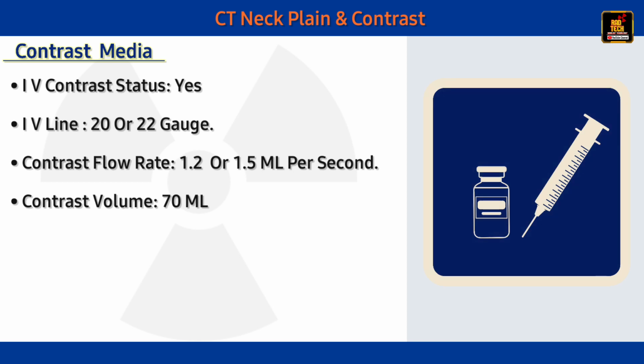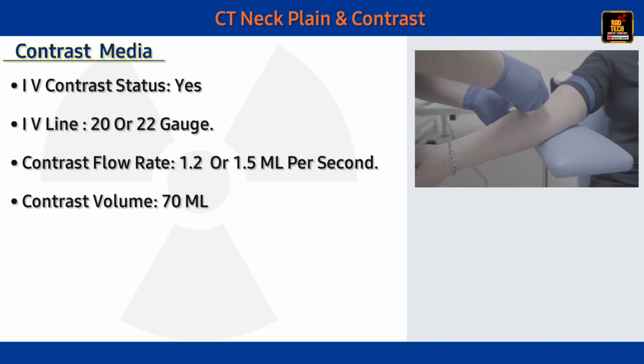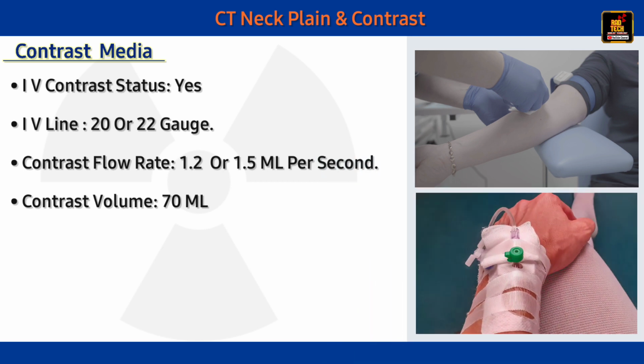Contrast media. IV contrast status, yes. IV line, 20 or 22 gauge. Contrast flow rate, 1.2 or 1.5 ml per second. Contrast volume, 70 ml.